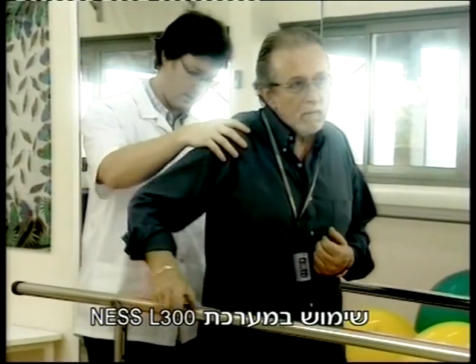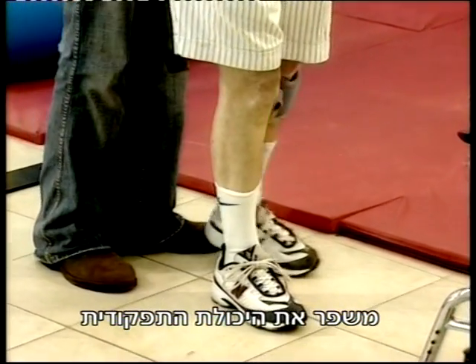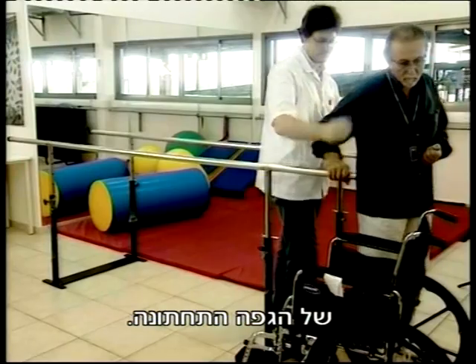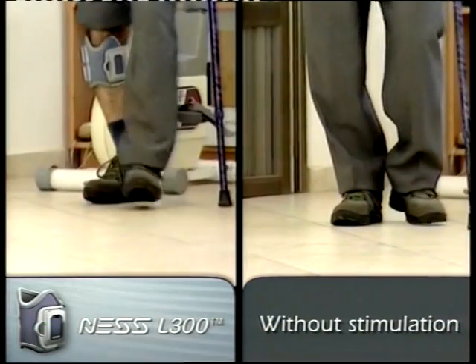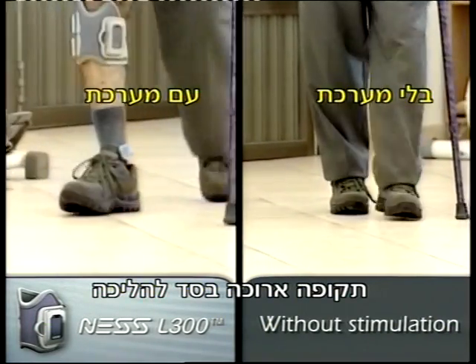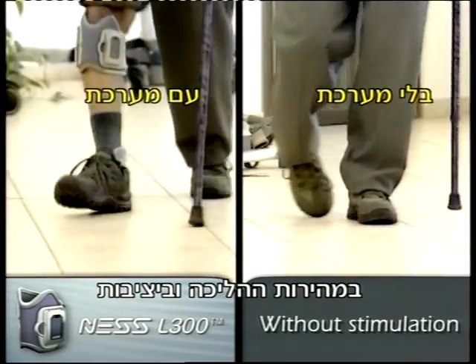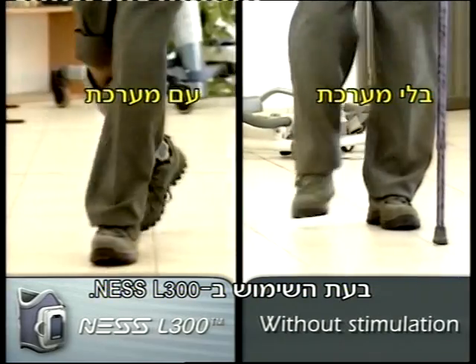Early implementation of the Ness L300 neuroprosthesis optimizes lower extremity rehabilitation results. Additionally, even long-term users of rigid foot drop splints may experience dramatic improvements in gait rhythm and steadiness by using the Ness L300.